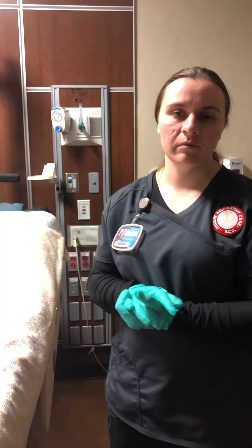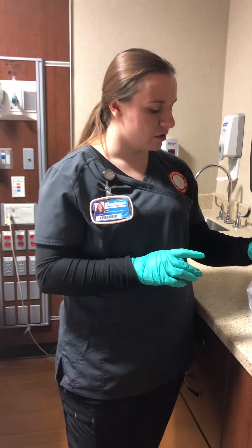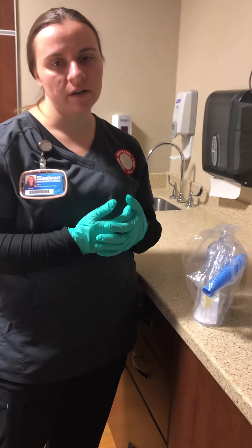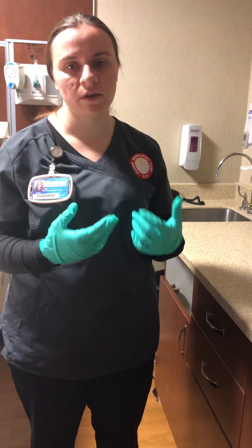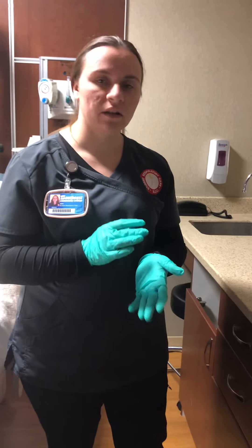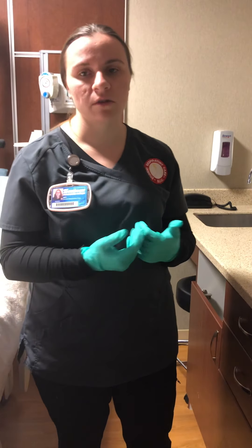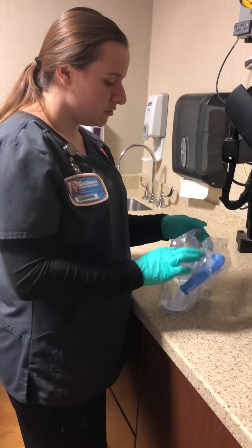When I'm ready I will let the patient know what we are going to be doing. Here I have a volumetric exerciser. This is going to help expand your lungs, help clear out and loosen any secretions, and strengthen the lungs to be able to cough up secretions. This will help prevent atelectasis and improve breath sounds after treatment.